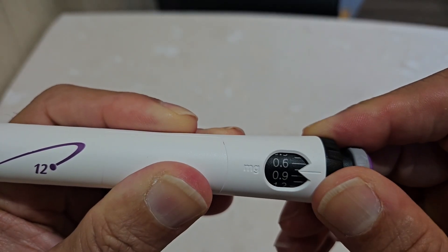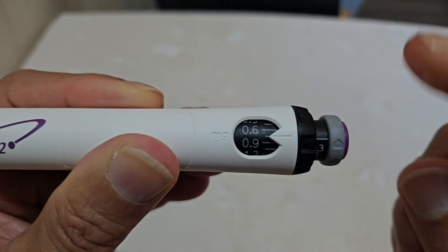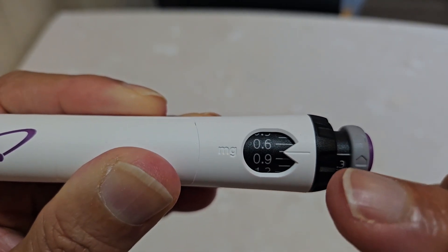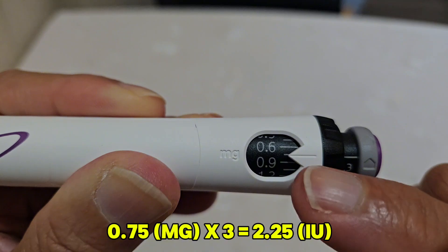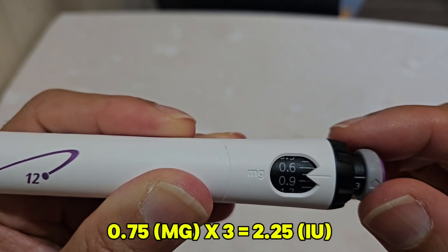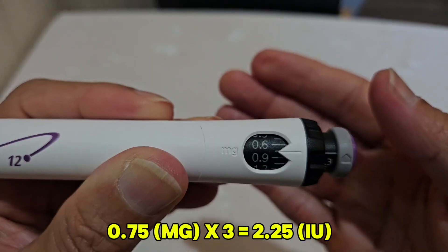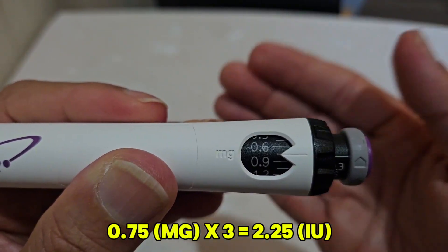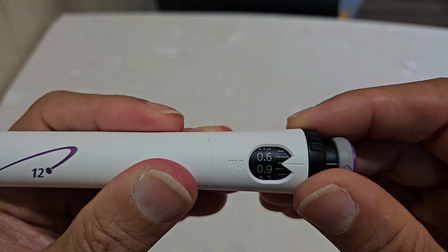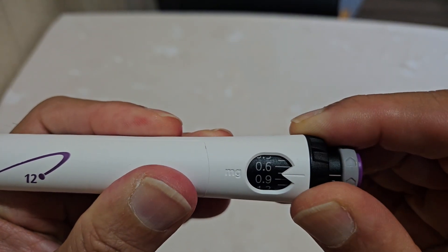If you change the dial, you can go in any direction. If you go between 0.6 and 0.9, you're setting it at 0.75. Multiply 0.75 by 3 and you get exactly 2.25 international units per injection.